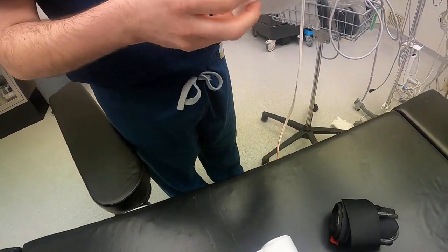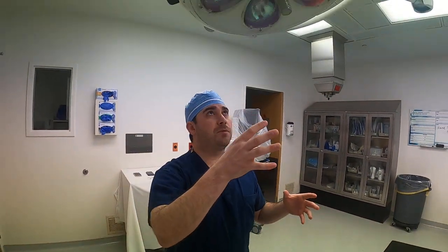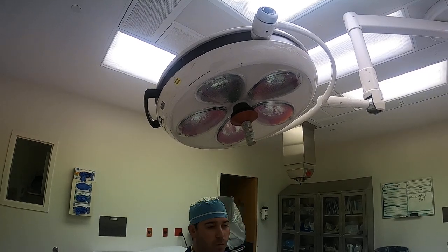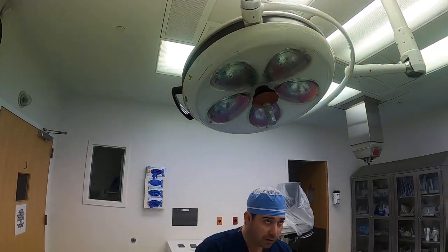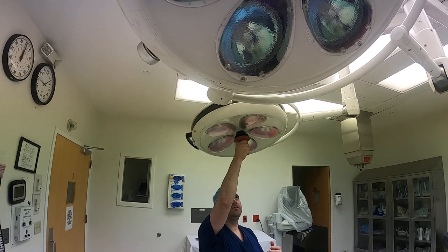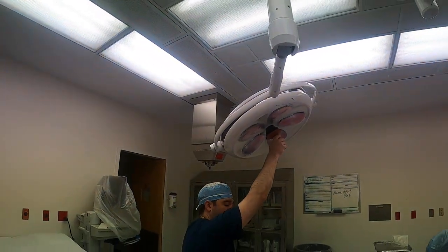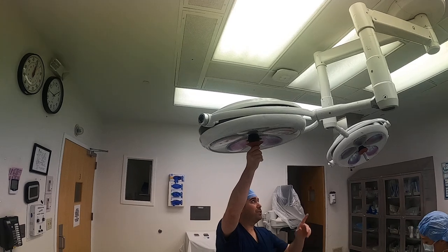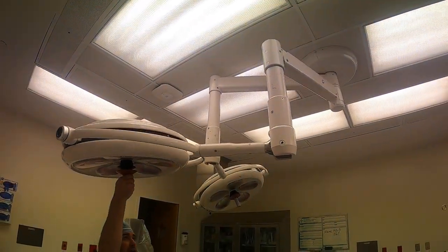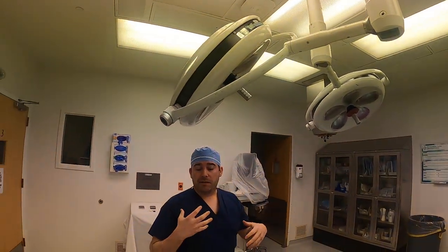While the surgeon gets ready, let's go over how to do the OR lights. Before everything is prepped, you can touch whatever you want — it's smart to position the lights toward where they'll be needed. Right now one light is pointing at the floor and one at anesthesia, so they need to be moved. Before the field is sterile, grab the light handle and move it. Since we're working on the foot and ankle, point both lights toward that area.